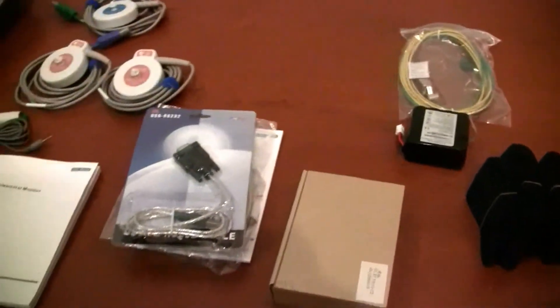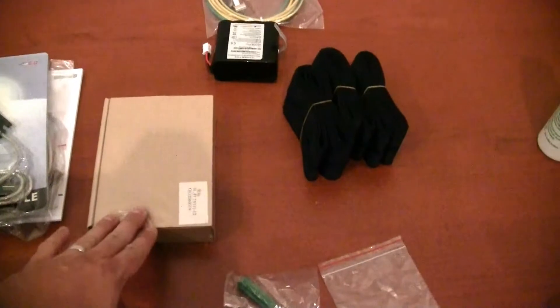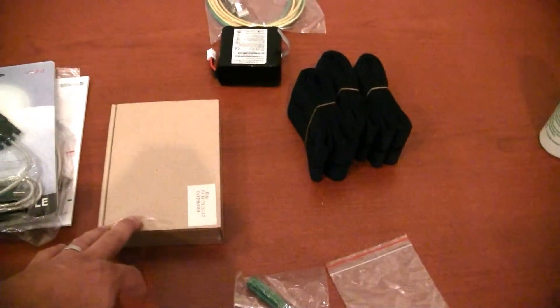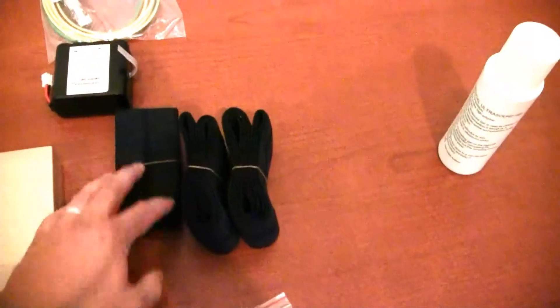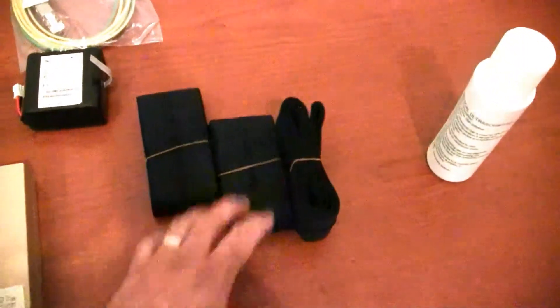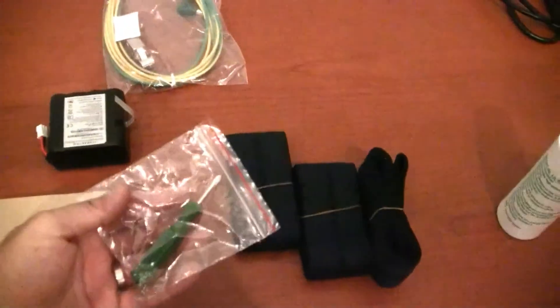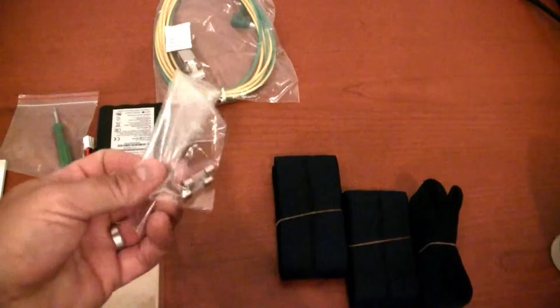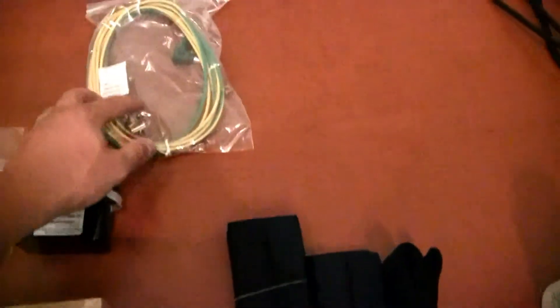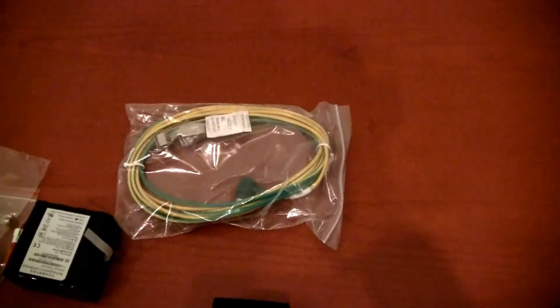Everything you need to run tests comes with the unit right out of the box, including a box of paper — three packs. Your fetal monitoring belts for your TOCO and your transducer. A battery as well, and we include the screwdriver to install the battery in the back of the device. There are also some extra fuses in case one should happen to burn out.